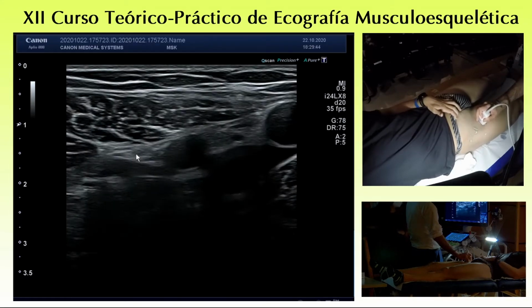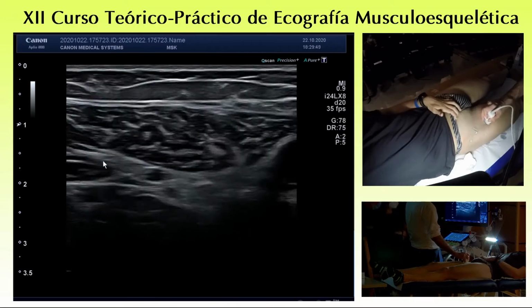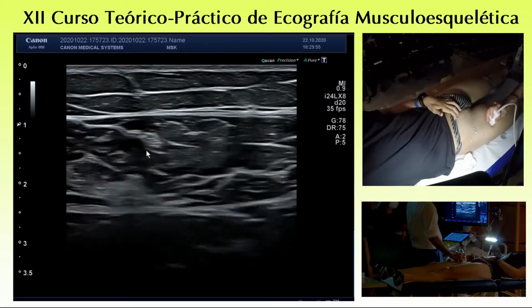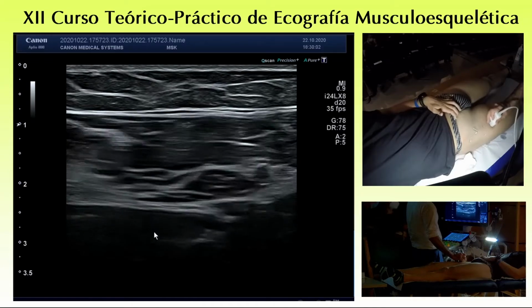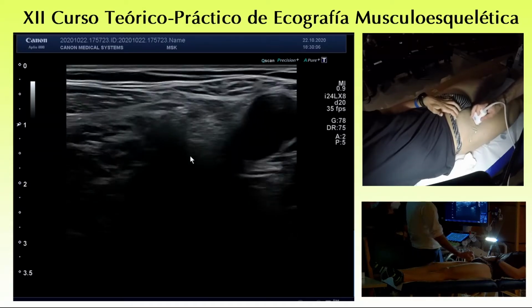The lateral one goes to innervate the rectus femoris, and all the muscles of the quadriceps. You see, this is the rectus femoris. You recognize that, and the vastus intermedius, like this one, or the vastus lateralis. So basically, these are all muscular branches.